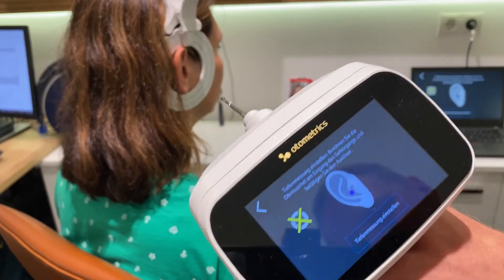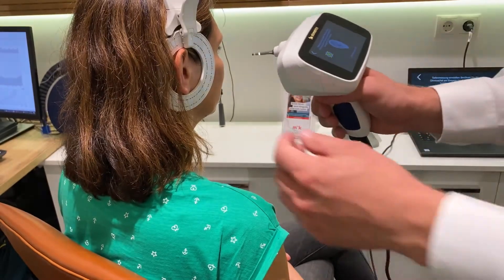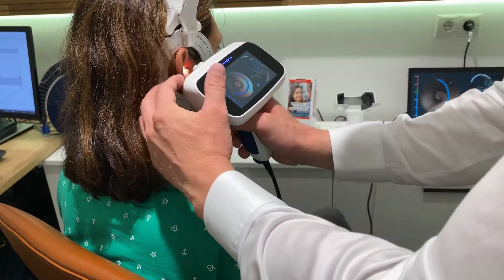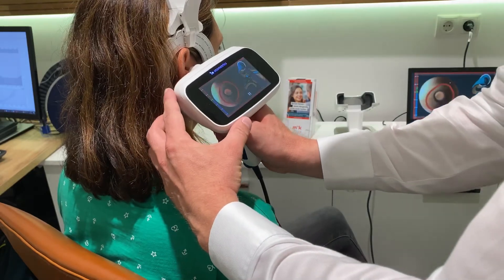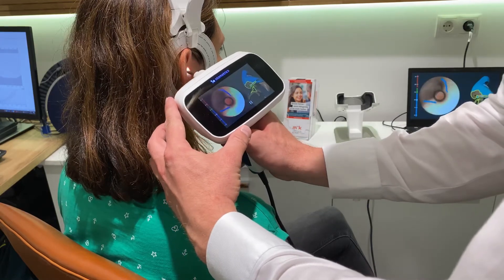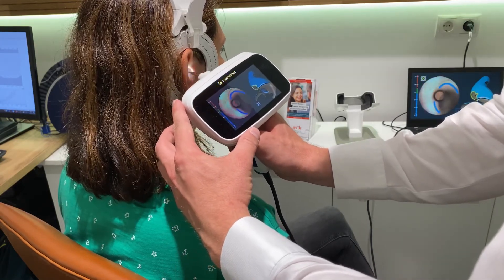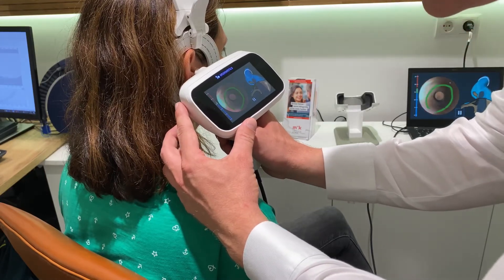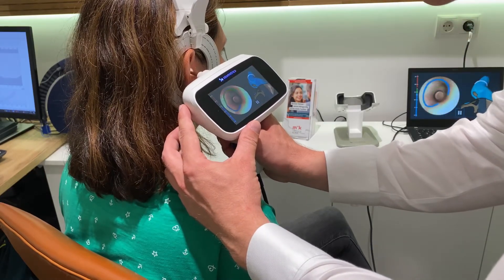Here we go. I start with the right side. I have to touch the skin and press start, and then I'm going into the ear canal. I try to go very deep. We will make some IICs out of this impression. As you can see, this goes really deep.